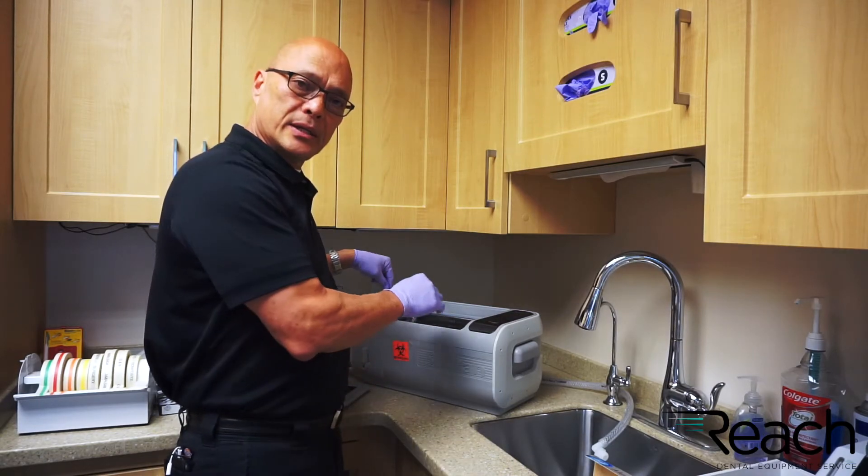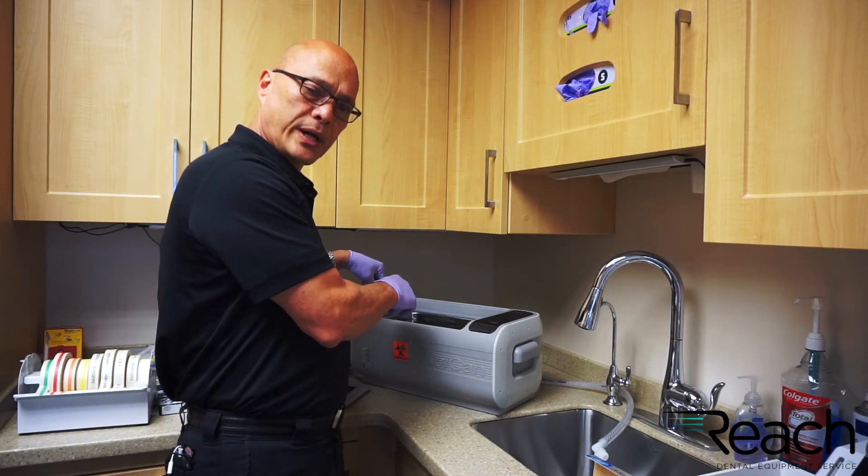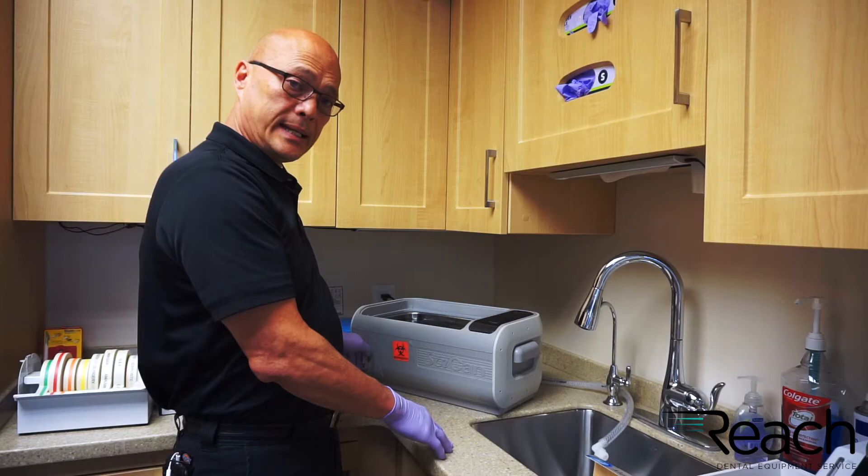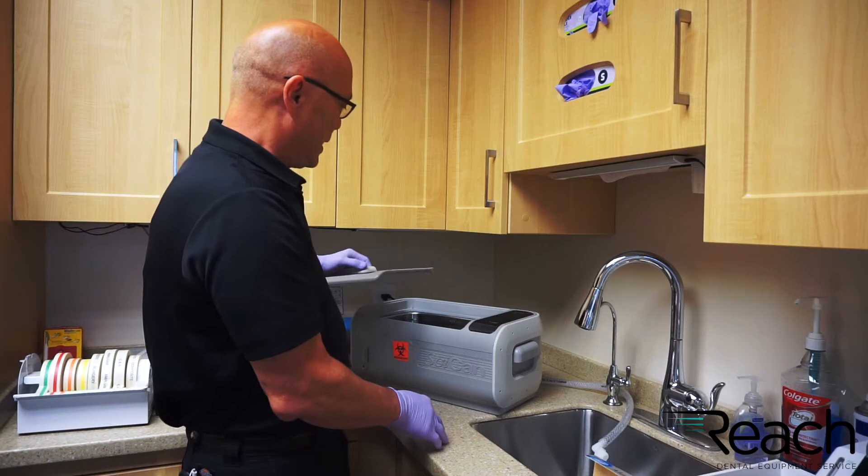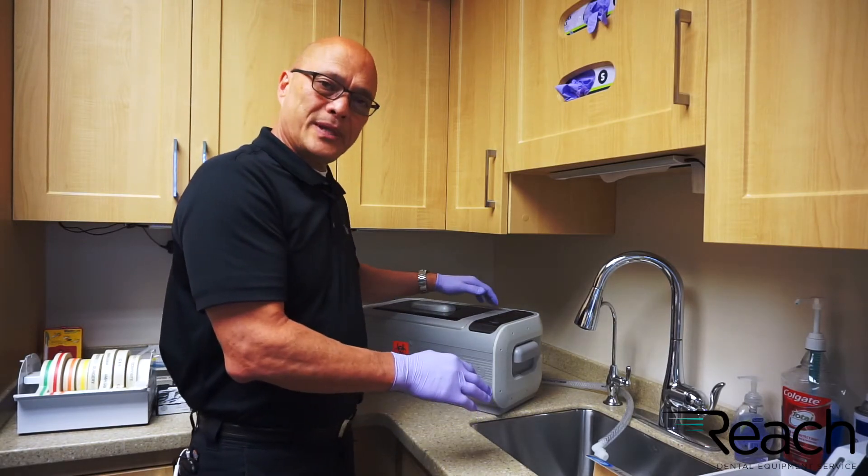Never operate it without a little screen in place down where the drain is. You should drain these daily — each one is different but there's a manual drain to drain all the liquid out. And that's your tip of the day.